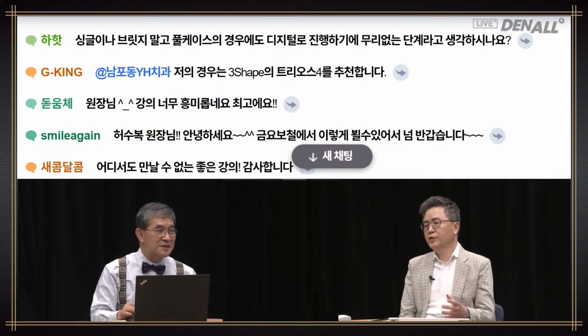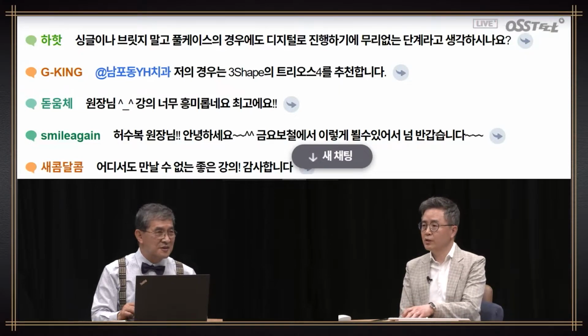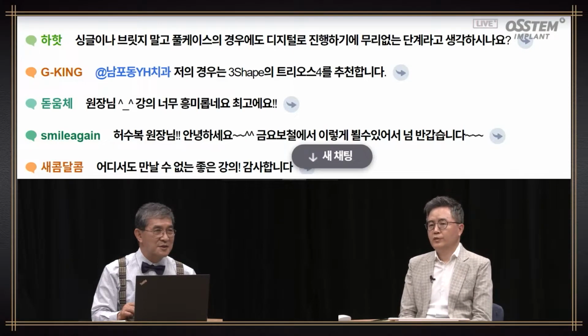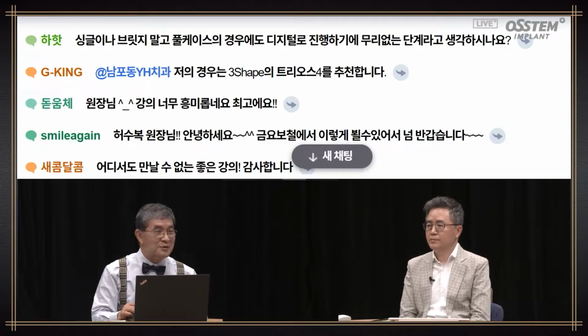If you look at excellent dentists, they know the distortion rate. They consider that as they work with CAD, but it's something only they can do. It's not something that an average dentist can do by putting in an average amount of effort. If that protocol is something that only the outstanding can achieve, that's not the way we should head forward. I think we will be able to continue to advance so that full mouth cases can be addressed fully.